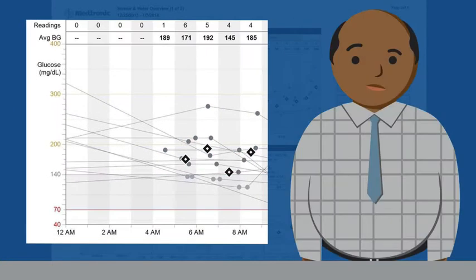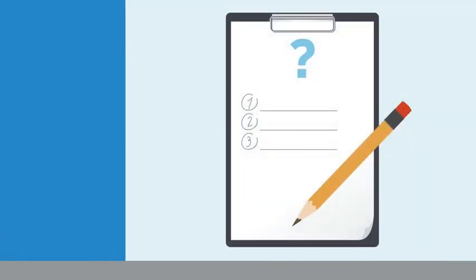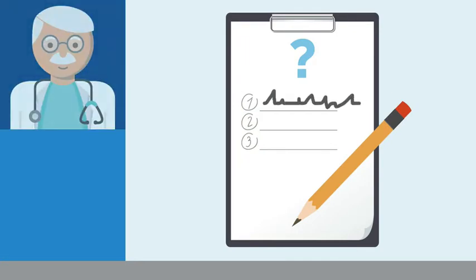Connor had noticed, just today, that lately his morning sugar was high, usually above 180. Now that he can see many days all at once, he realizes he has a pattern of high blood sugars in the morning. Connor makes note of this so he can talk to his doctor about what he found.